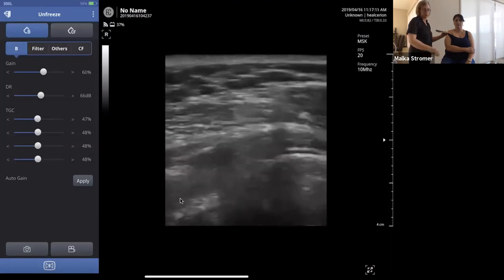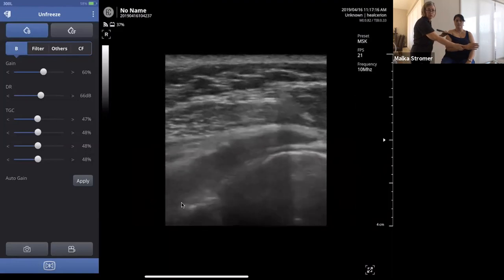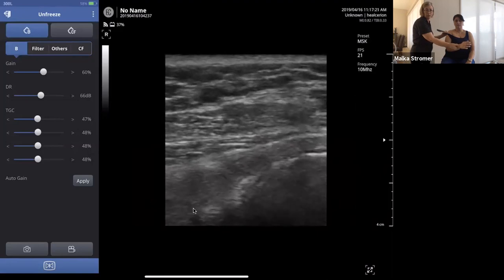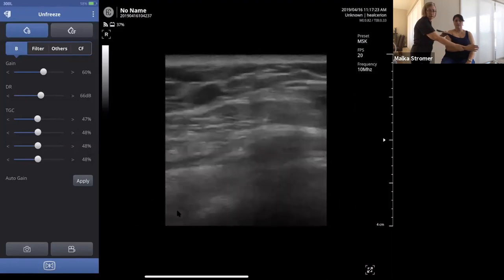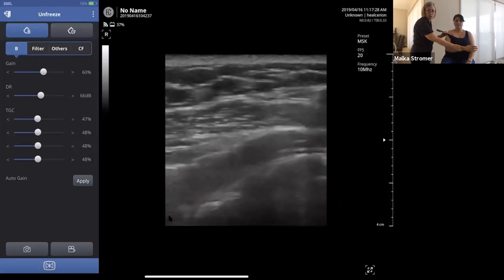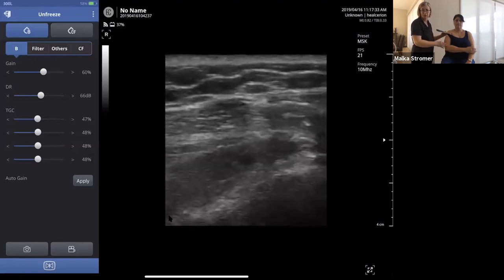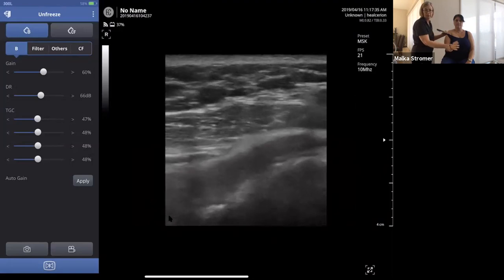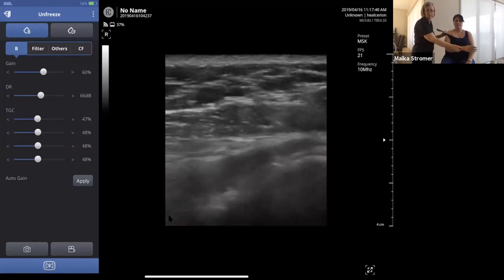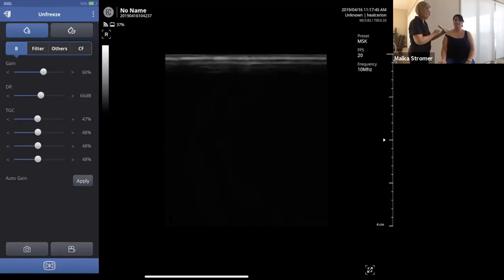Into the posterior joint. Now I'll externally rotate her. You can see where the humerus comes down. The labrum will be in that little V right there with the glenoid to the left. So you can look for impingement in through here, fibrosis, calcifications in through there. And then the infraspinatus muscle, we'll see it moving. Okay, back to a neutral position.